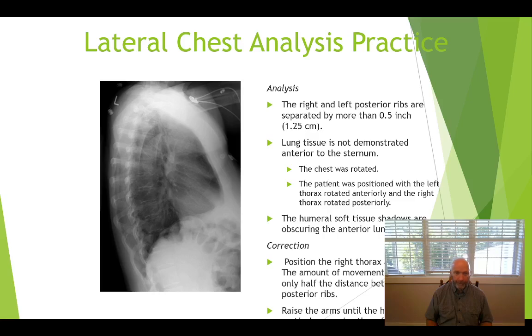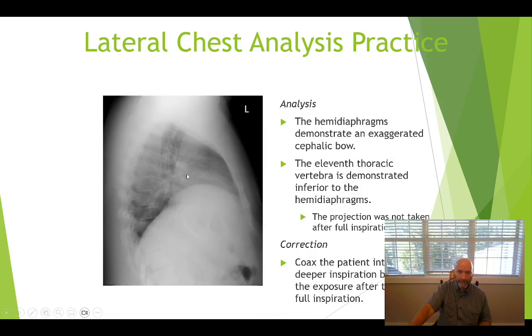What are they looking for? And how much misery is it going to cause a patient to repeat it? And certainly if you've got a radiologist close, you might want to bend their ear and say, hey, can you see what you need to see on this before you go back in and wrestle this patient to try to get a better exam?